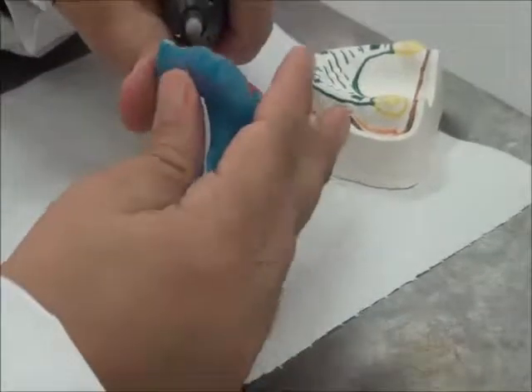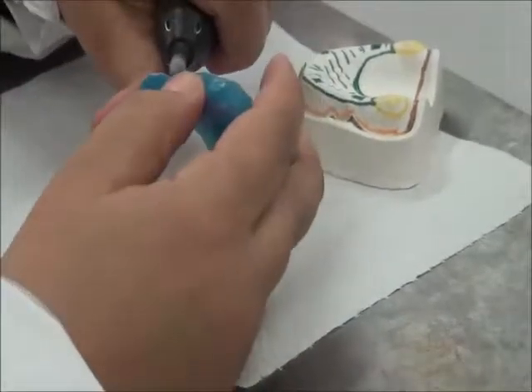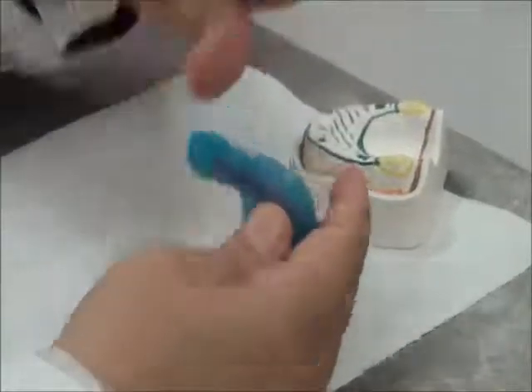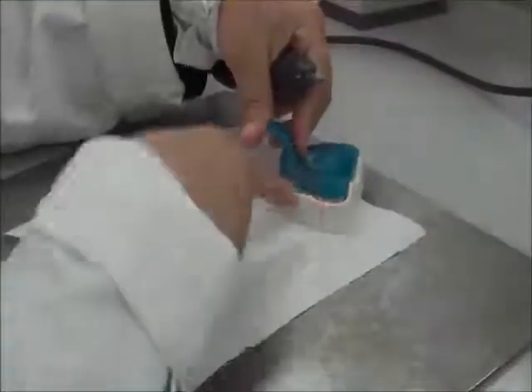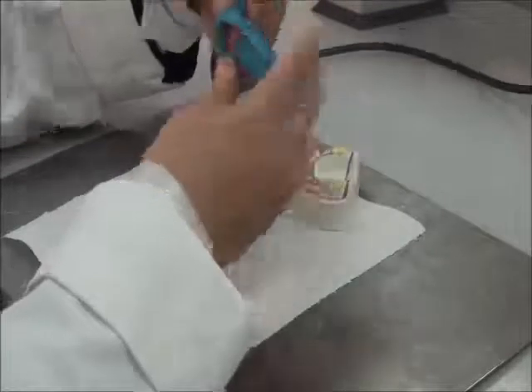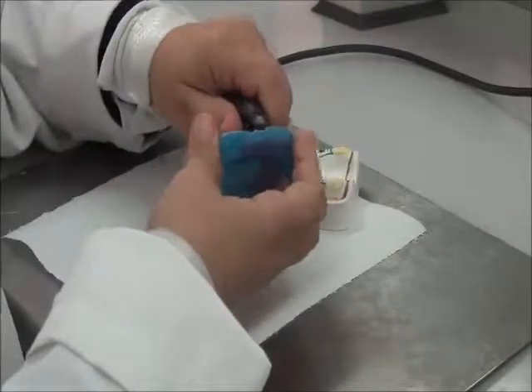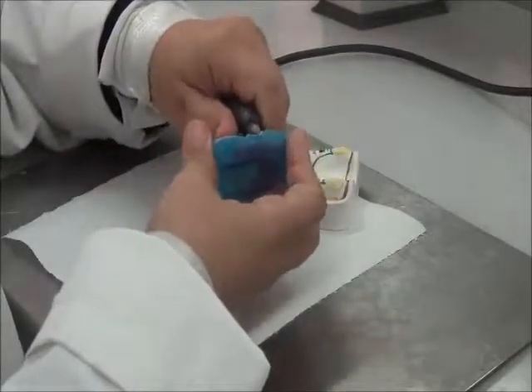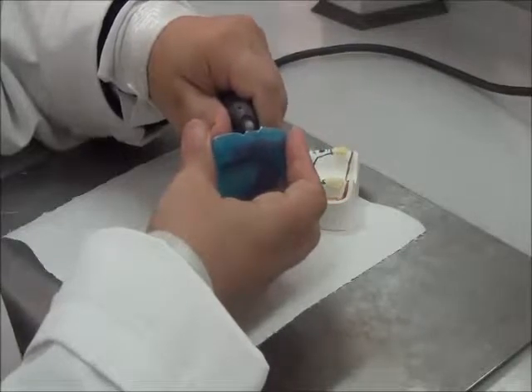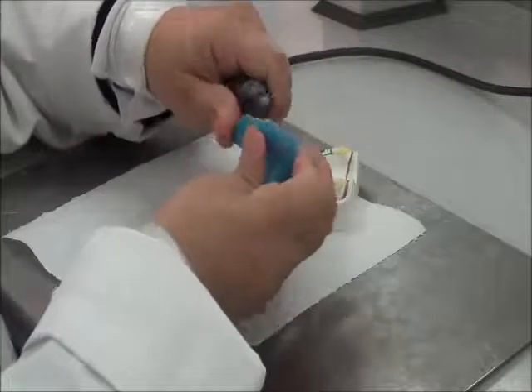In the areas where we have a free frenum, I open the notch. These are the areas where we had the frenum on the cast. If I place it now, you can see that for each frenum I should have a notch in the tray. This is a frenum area, and this is a frenum area. Make sure that the notches are clear in them.